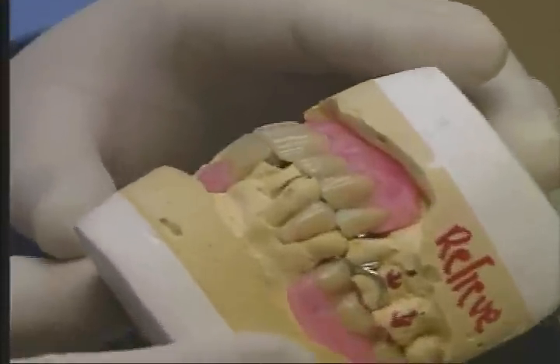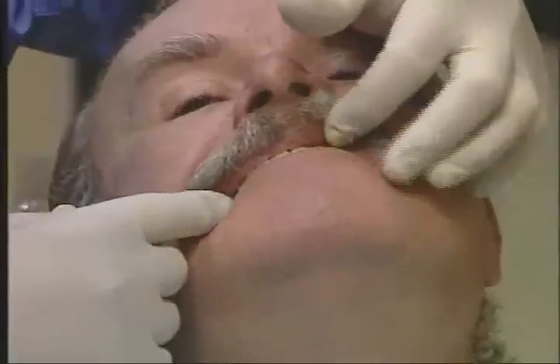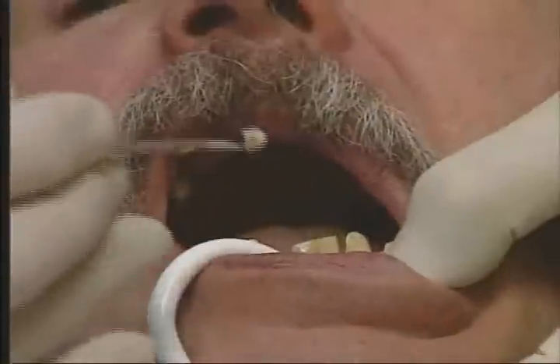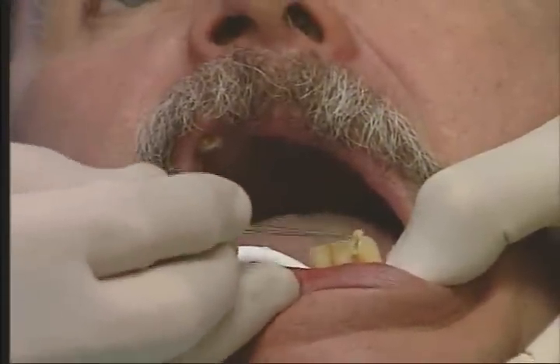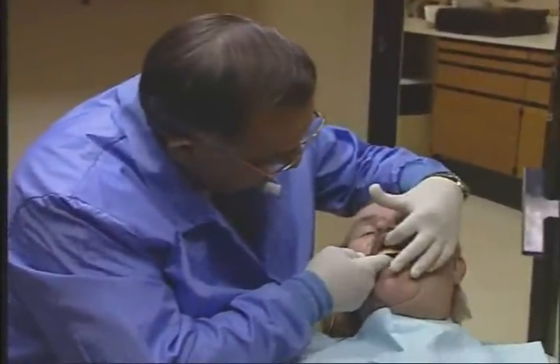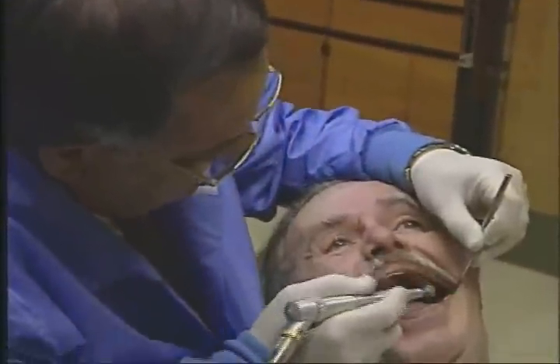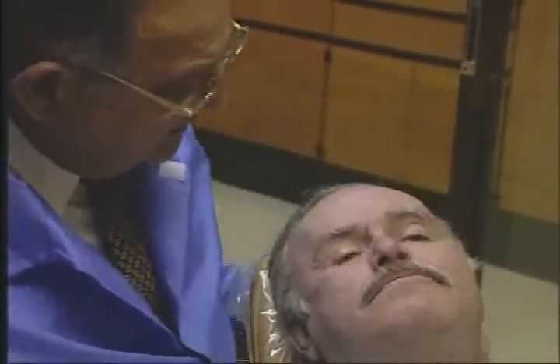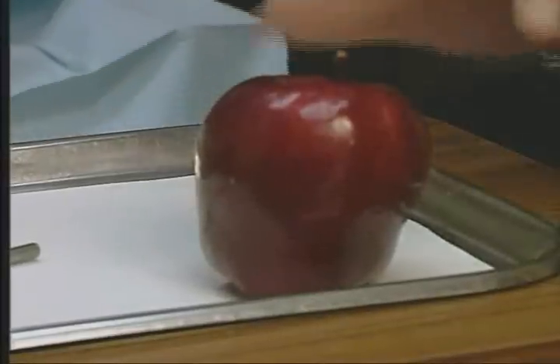Visit 4: The Equipoise partial denture with teeth set in wax is tried in the patient's mouth and vertical and centric relationships are confirmed. The aesthetics are approved by both the patient and the doctor. Before the patient is dismissed, the interproximal space must be preserved by placing a light-cure composite in the prepared area. The case is now returned to the Equipoise certified laboratory for processing. Visit 5: The prosthesis is inserted into the patient's mouth. All prematurities are corrected and the patient is instructed in the proper care and insertion and removal of their Equipoise partial denture. Five visits are not always necessary — use your judgment as to how many visits are necessary. The case should be completed in approximately two hours of chairside time.